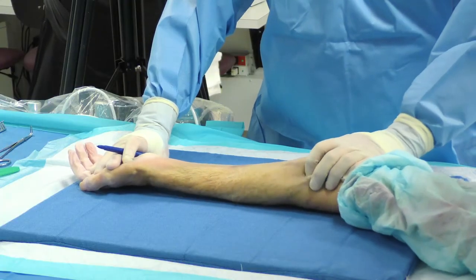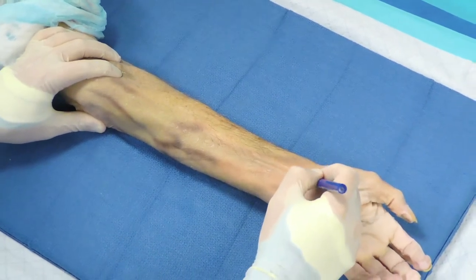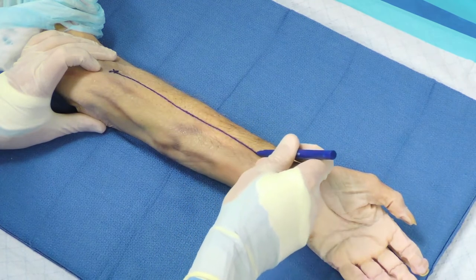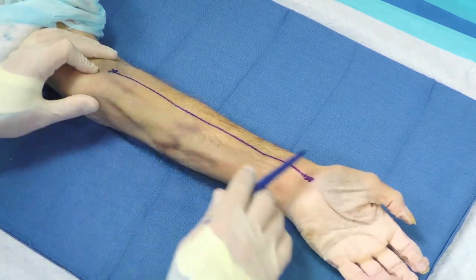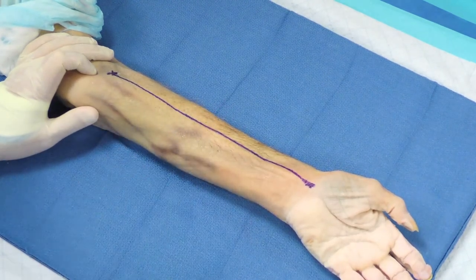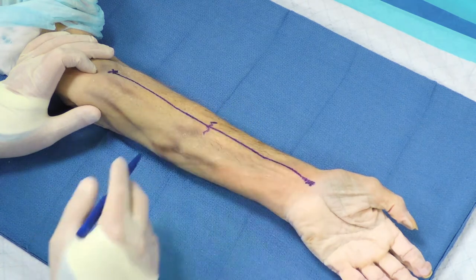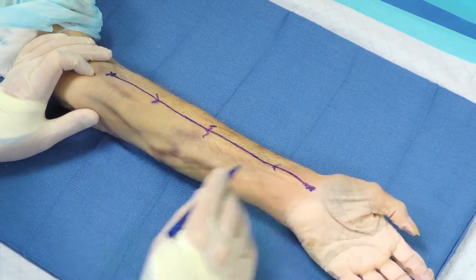I can feel the biceps tendon right here and here is the FCR crossing the wrist crease. I'm going to connect those two lines, and we can cut anywhere along this to get to our fracture. We'll suppose today that we have a mid-shaft fracture, which is probably the most common type of forearm fracture that we see. For a standard approach to this fracture line, we'll use somewhere along this incision from this arrow to this arrow.